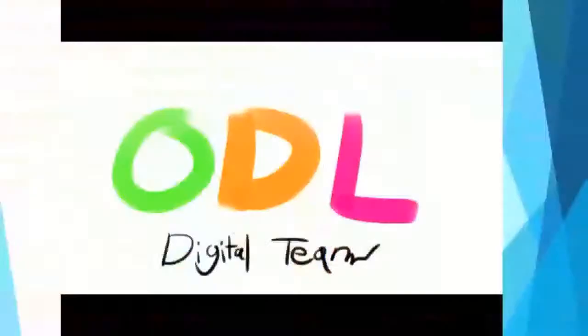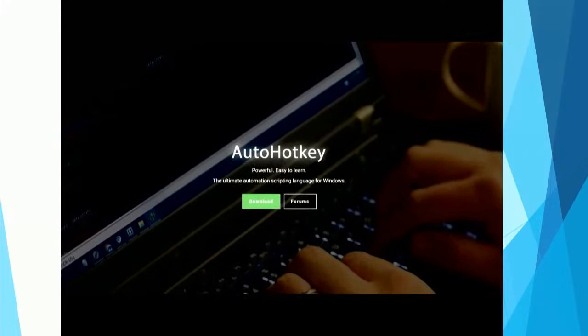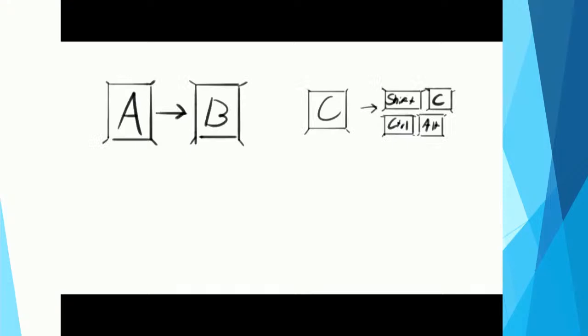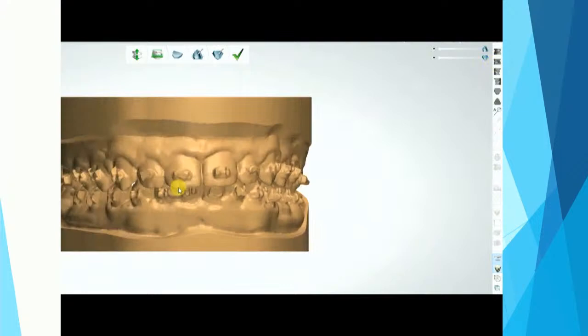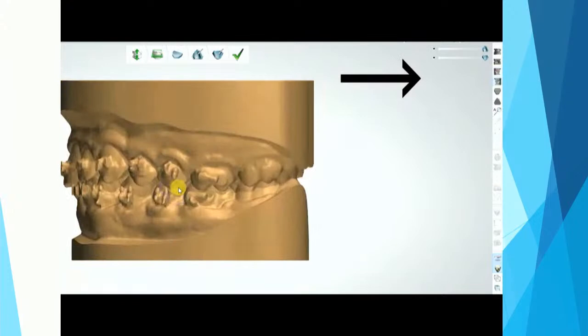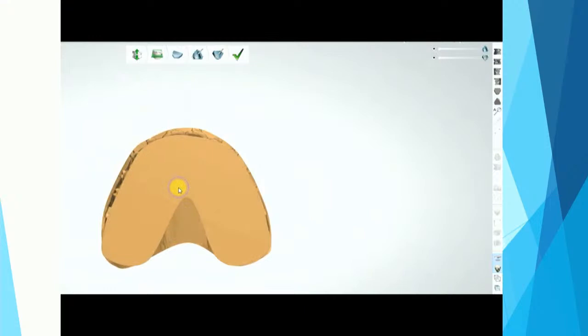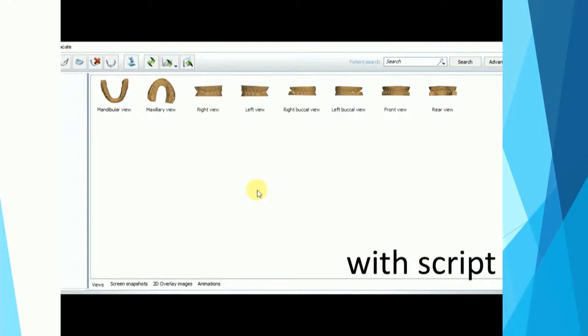Hi, this is Daniel from the ODL digital team. Our best two-second improvement is implementing AutoHotKey into our workflow. It's an easy-to-learn scripting language we've used to remap keys and automate simple actions. It can remap one key to another, press multiple keys at once or in sequence, and perform mouse clicks at specific coordinates—all software specific. In OrthoAnalyzer, I've mapped view buttons to the numpad, which eliminates mouse and eye travel so we can focus on prepping the model. Exporting models normally requires opening a menu, clicking the right option, and closing a popup. Using a script speeds this up and completely eliminates any chance of misclicking.